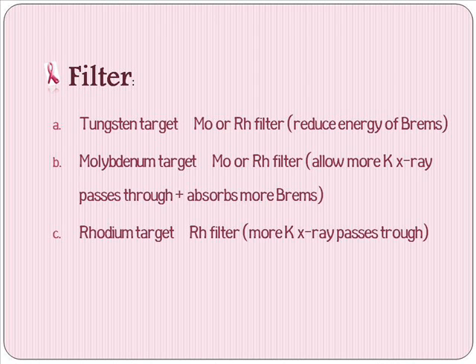For the mammography added filter, we often choose a filter which has the same composition as the target, which is the anode, because we want to allow more characteristic X-ray to pass through and more high energy Bremsstrahlung radiation is absorbed.